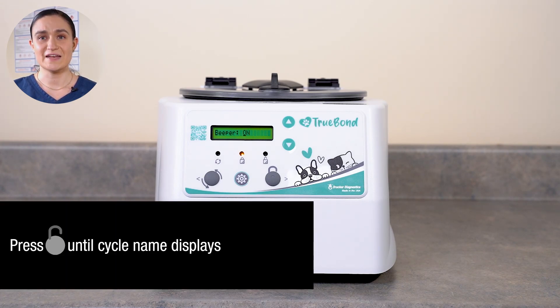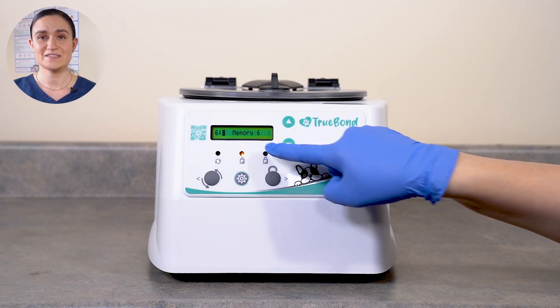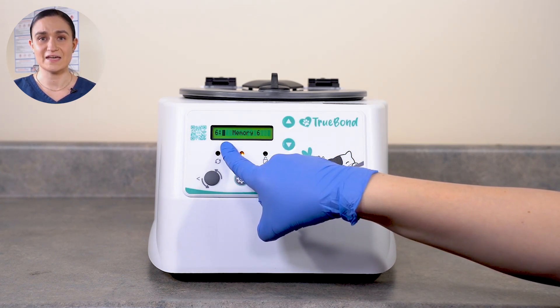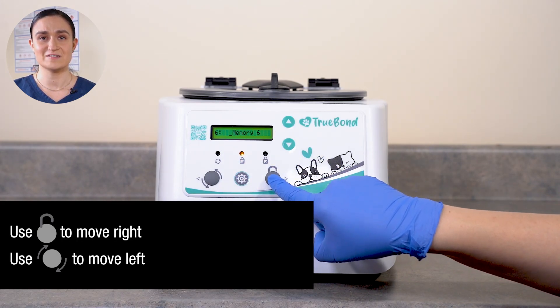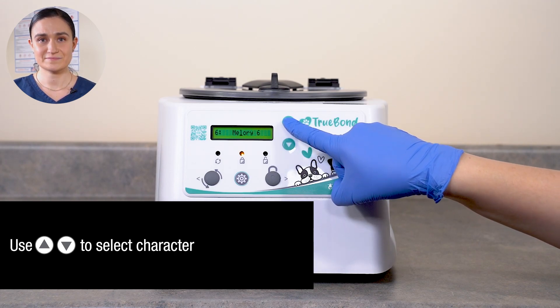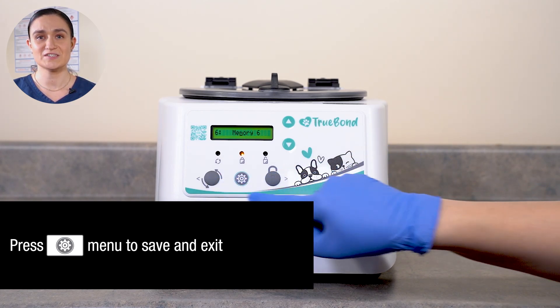Once your audible alerts setting is set, press Stop Unlock again. You'll see the name of the cycle displayed, indicating that you are editing that cycle name. Name is edited character by character. Your currently selected character is indicated by the letter flashing, or by a flashing rectangle if blank. Use the Start and Stop Unlock buttons to move between different characters in the name, and use the up and down arrow buttons to adjust each character as desired. Once your name is set, press Menu again to save all of your changes and exit.